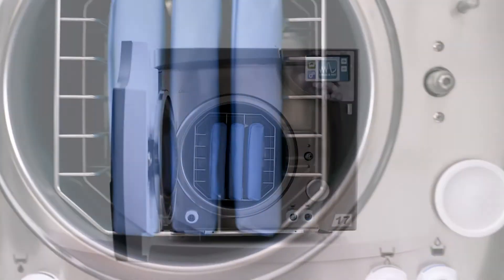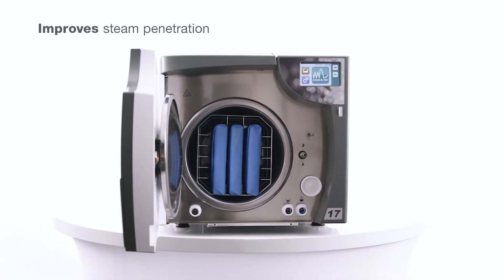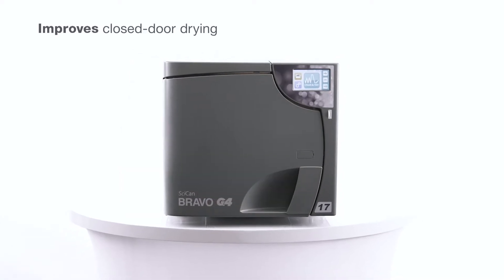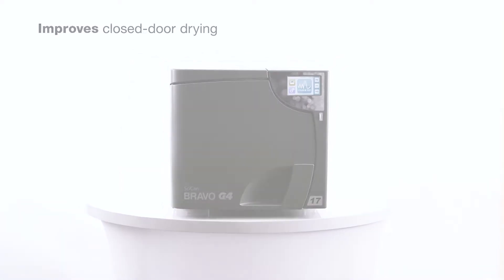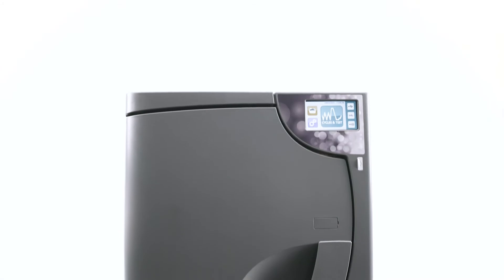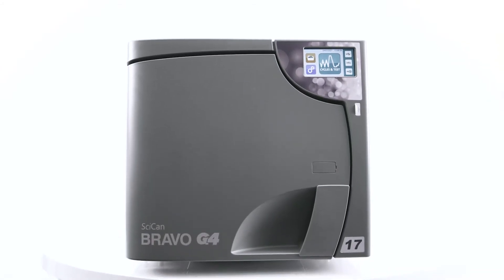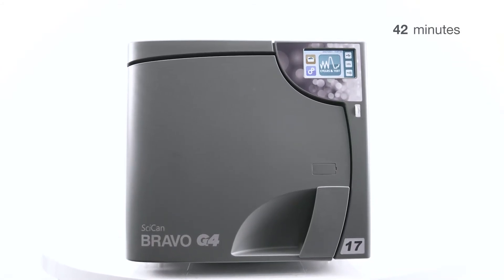Incorporating both pre-sterilization vacuum to improve steam penetration and post-sterilization vacuum to improve closed-door drying, Bravo G4 efficiently delivers sterilized and dried-wrapped instruments in as little as 42 minutes.